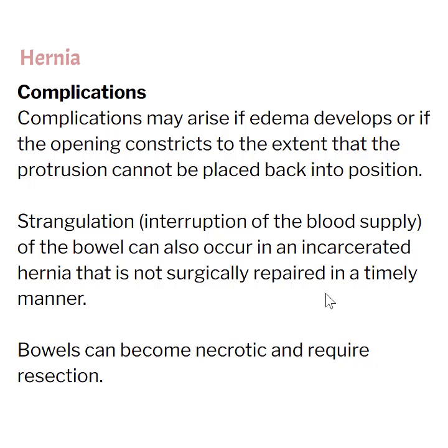Now there are some complications that can come along with hernias, and as a sonographer, you want to evaluate where the patient is with any of these complications that can occur. Now one of the big things that we see with hernias is that if you push a little bit on the hernia, you can reduce it, which means it goes back into position. So if you put a little bit of pressure on the hernia and it goes back in, that's a good sign.